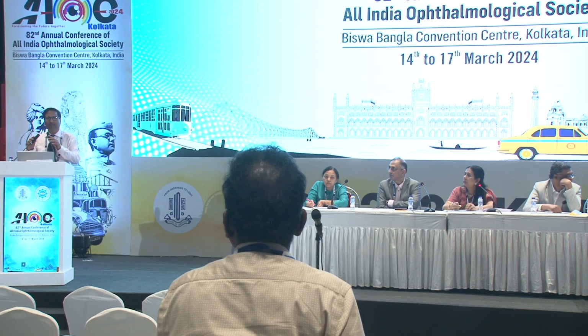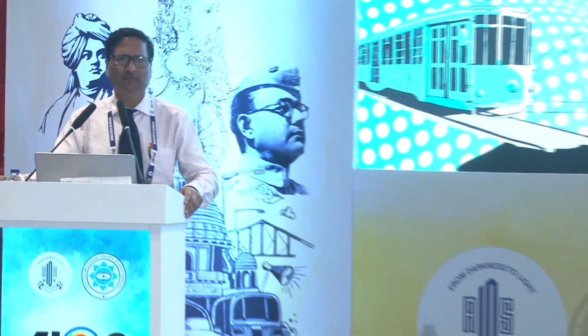No, it is a vitrectomized eye. Right. There is a pressure inside the vitreous cavity that will automatically drain the blood from the vitreous cavity. Only till the tip of the needle. But what about the blood which is collected below the level of the needle? Over the disc it will not be drained. The aim is around 80 to 90% drainage. 10 to 20% even if it remains, it won't create any problem, because it will get absorbed with time.